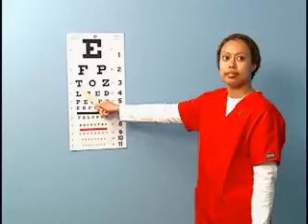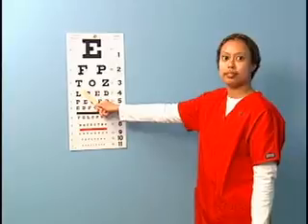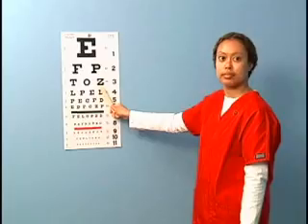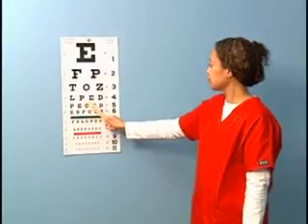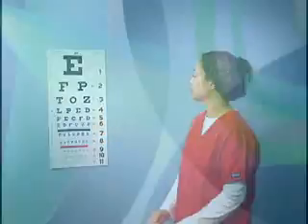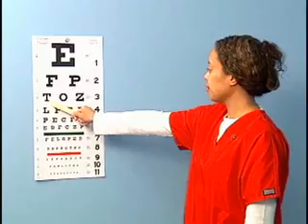Start by pointing to a line that is several lines above 20/20 to give the patient confidence and help him become familiar with the procedure. A suggestion is to start with the 20/70 line. Ask the patient to say aloud what she sees on the line. If the patient can read the 20/70 line, proceed down the chart until reaching the smallest line of letters the patient can read. If the patient is unable to read the 20/70 line, go up the chart until you reach the smallest line she can read.